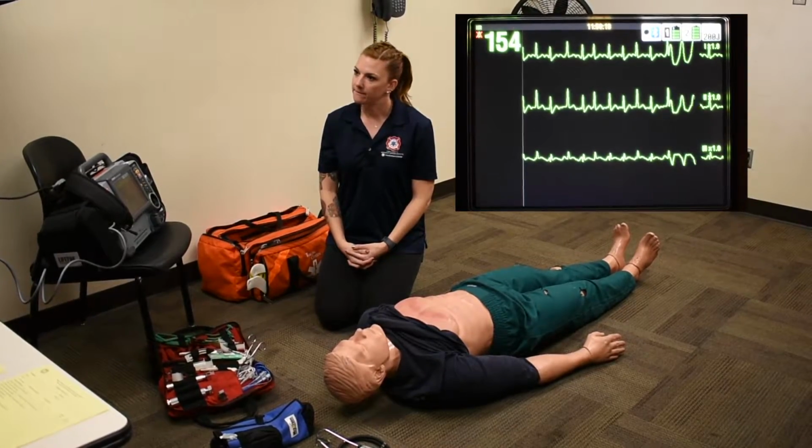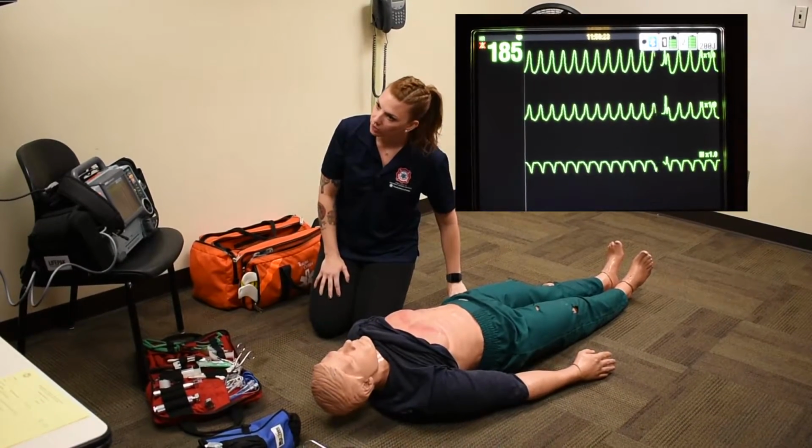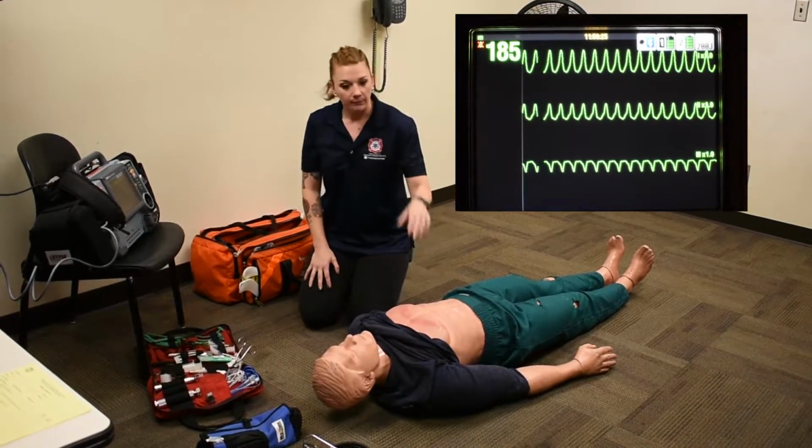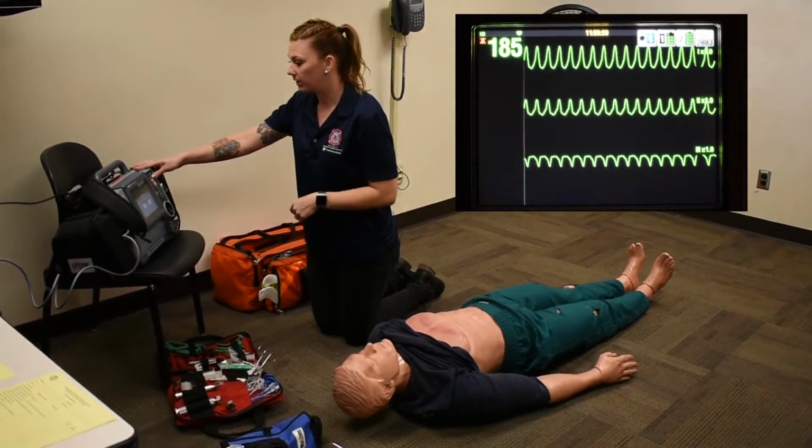You notice that your patient suddenly loses consciousness. Okay, on my monitor I'm seeing VTAC. Does my patient have a pulse? The patient does not have a pulse. Okay, I'm going to go ahead and have someone start CPR. While they are doing CPR, I'm going to charge and shock because I saw it.